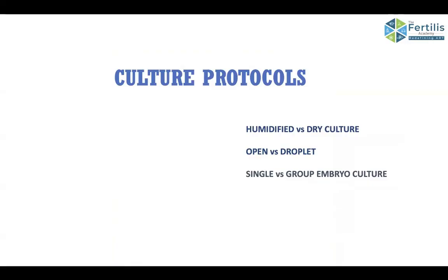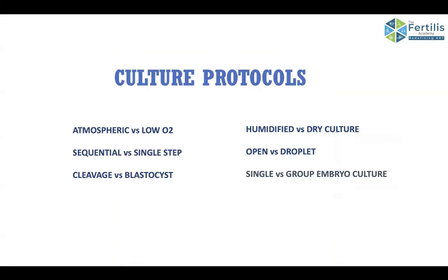I think we have to cover culture protocols also. So when you talk about culture protocols, I'll just take the gist of it. I'll not spend too much time on this. When you talk about humidified versus dry culture, then we'll talk about open versus droplet and single versus group embryo culture. We'll also talk about atmospheric versus low oxygen, which we already discussed, that low oxygen is a better way of incubating. Cleavage versus blastocyst, and sequential versus single step. So we'll just talk about the take-home message in these.